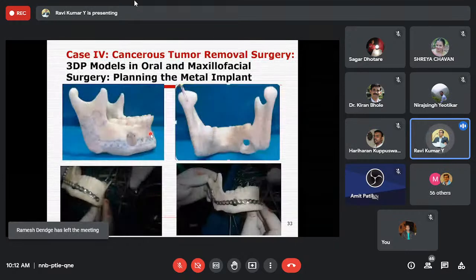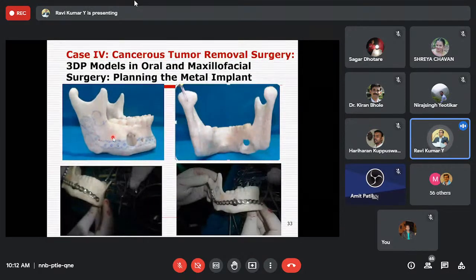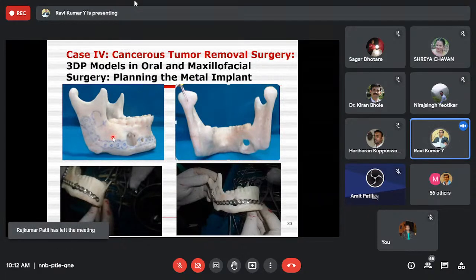And you may wonder why still that models are not gone inside the patient's mouth. Then we came to know that there are several procedural things. Just like that we cannot implant inside the patient's mouth. We need to take clearances from the ethical clearance team and do the other formalities. Though we'll take the consent from the patient, still we need to follow several formalities or regulations. But at least this is our first attempt, but we could not succeed.